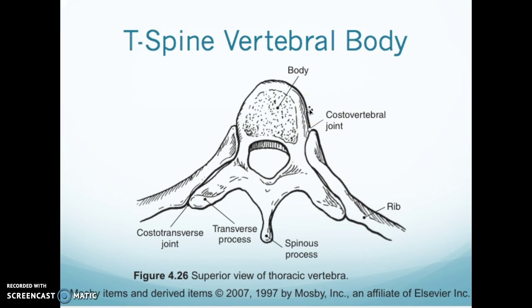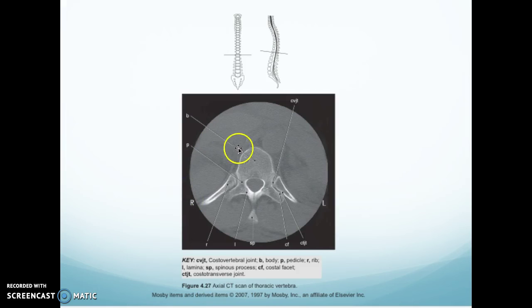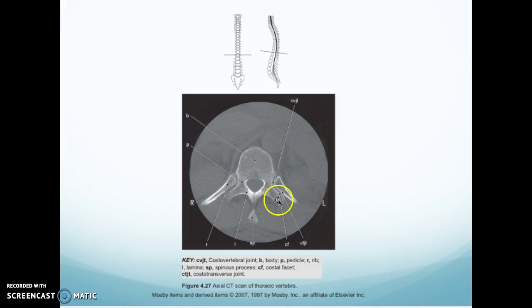Here is your T-spine vertebral body. You have your costovertebral joint at your rib and your costotransverse joint on the backside with your transverse process. Costotransverse is by the transverse process; costovertebral is by the vertebral body — that's how I remember the two different joints. You have your spinous process there. Looking here, this is your costovertebral joint with your costotransverse joint, your transverse process with your spinous process, your lamina, your rib coming across, your pedicle, and your body.